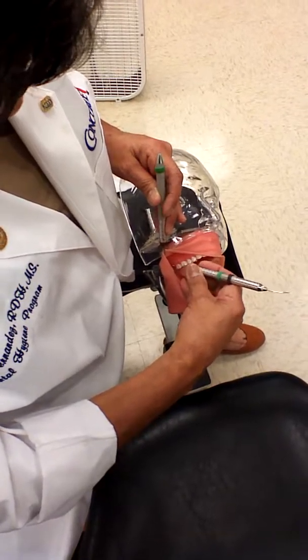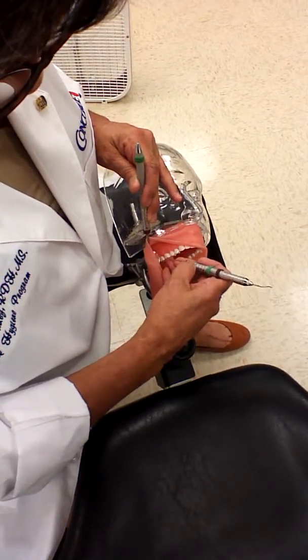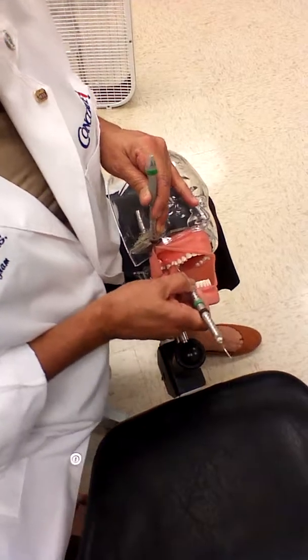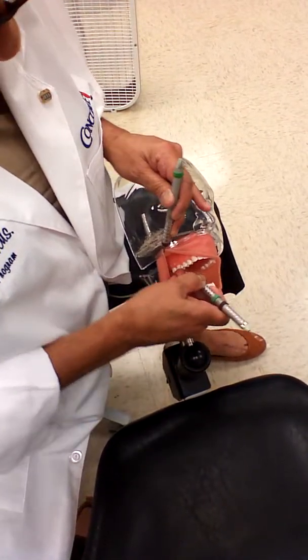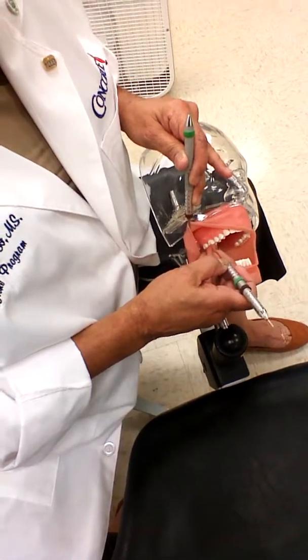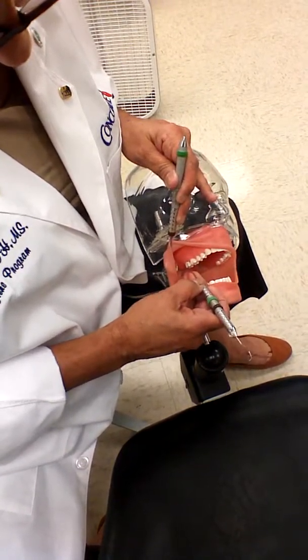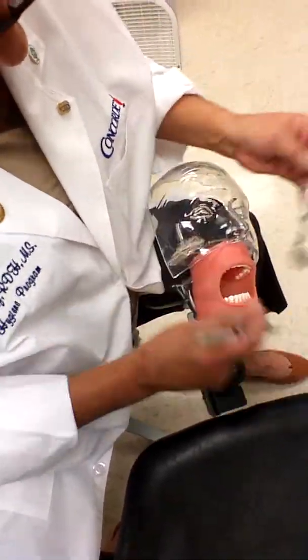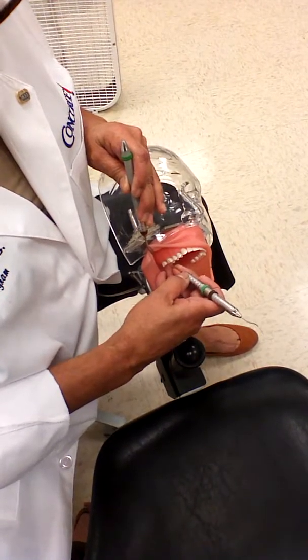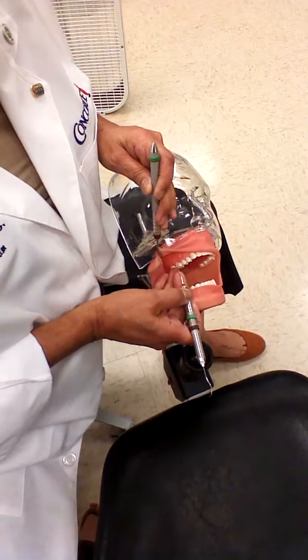And when I'm watching you guys do this, I would always much rather see you go really slow, really deliberate, so that I can see that stroke, because that's just sweeping around. That's not exploring. True exploring is overlapping. Don't miss those line angles. That's why everybody misses line angles right up in here. They leave deposit right up in here. Every time the tooth rounds, that's where they leave it. That's where they always miss, because you're not deliberate when you go around, and you don't pivot, and you don't keep those tips or those working ends adapted around there.